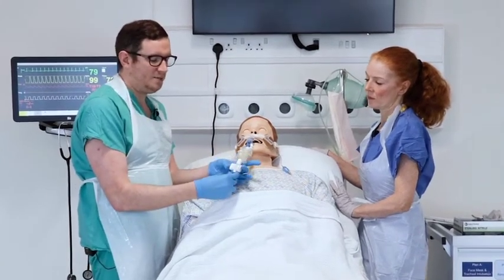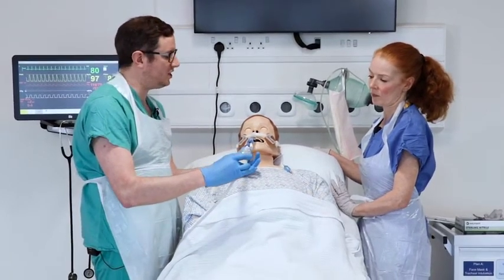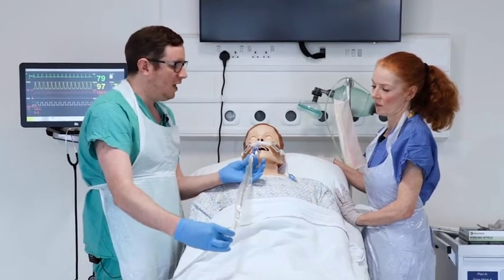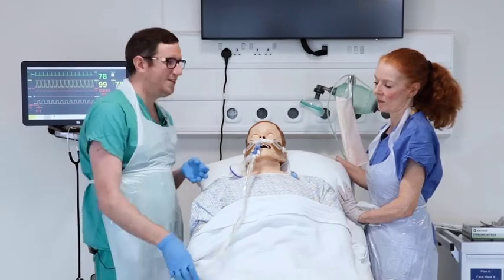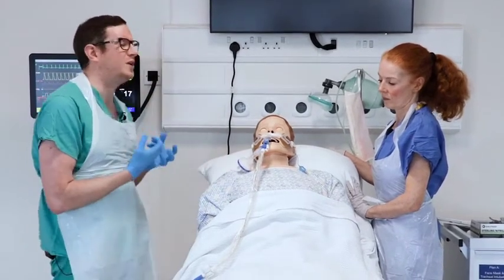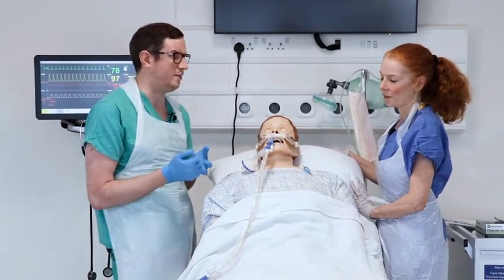To apply suction with this machine, press the parts together to start suctioning and slowly withdraw the catheter. Do this for a maximum of about 15 seconds — a slow count of 10 works for most people. Although it has been said that if you can hold your breath for that time your patient can too, remember these patients are critically ill and may not have the respiratory reserve we do, so stick to a slow count of 10.